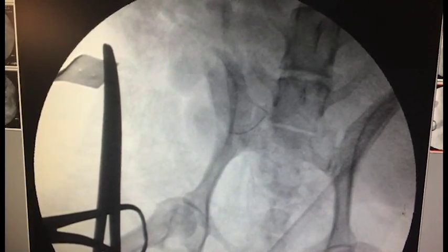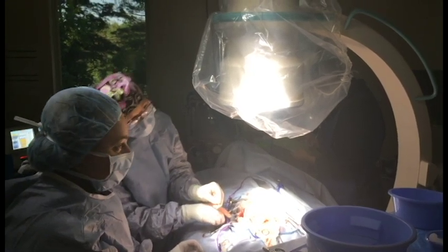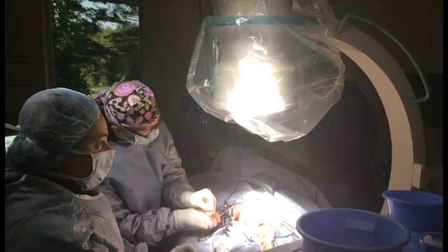And so what we did was we went in and we placed this slick little stent from the kidney down the ureter into the urinary bladder. And so this stent allows urine to kind of pass by those stones that were obstructing the flow of urine from the kidney into the urinary bladder. And that alleviates the obstruction and allows the urine to flow. And by doing so, we get to save a kidney, which is super cool.